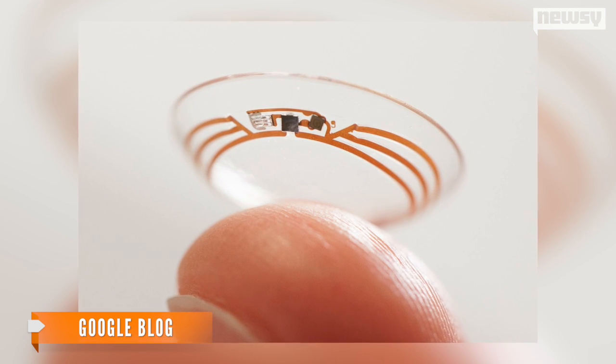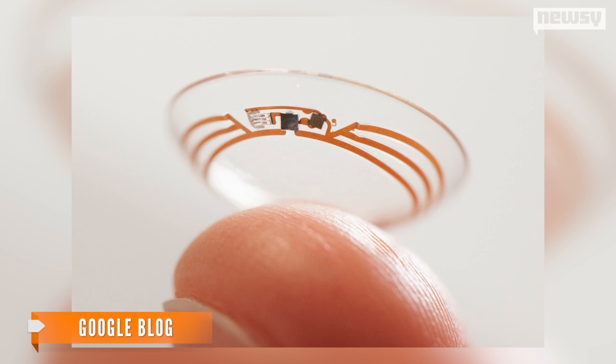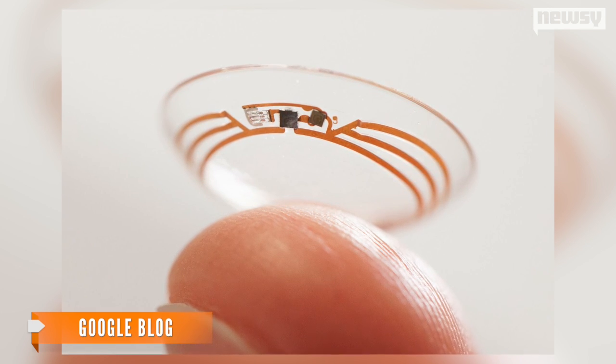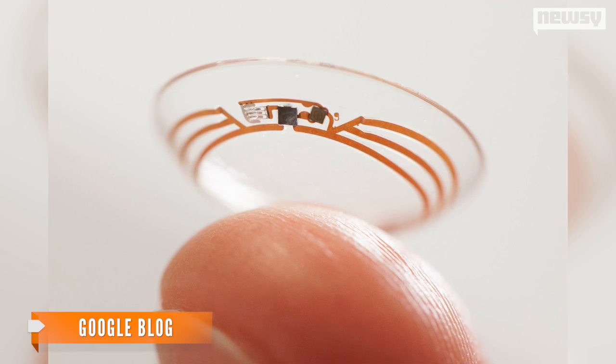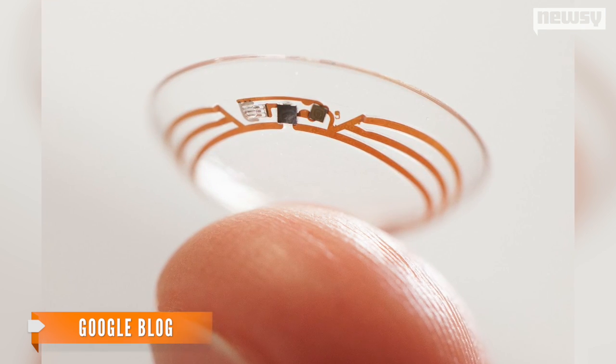And as you can see in the image Google posted on its official blog, it includes an extremely thin antenna that can connect to an app for monitoring levels. The company is also experimenting with LED lights to notify users of changes in glucose levels.